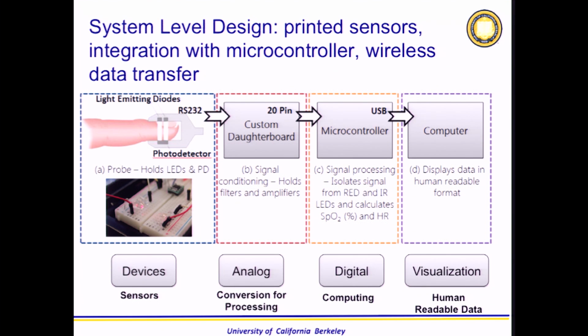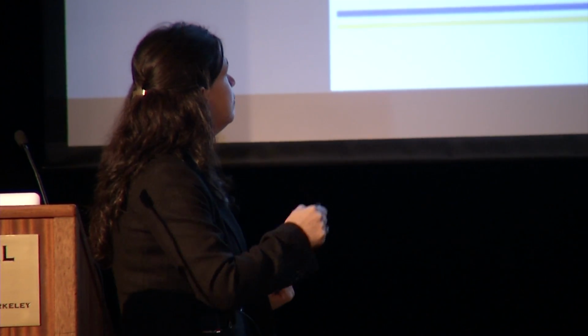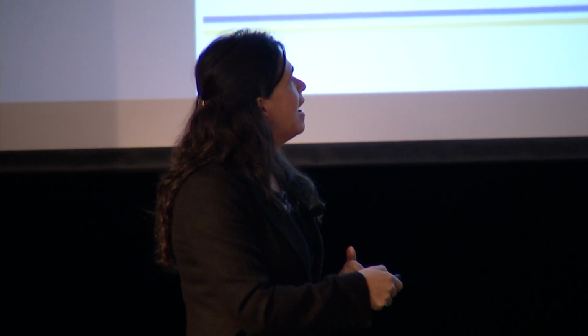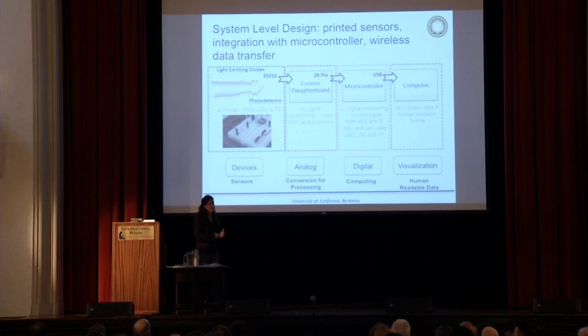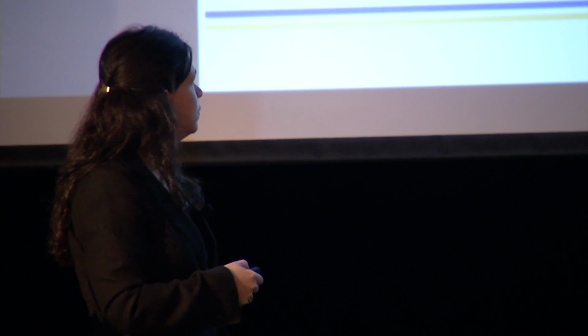So what I think in terms of flexibility, what needs to be flexible, what needs to be wearable, is that we could easily make the devices here and some of the analog circuitry flexible. We could transmit the data via RF, so that via wireless, so that we don't need to have those wires coming out of us anymore. And of course, this could be displayed in a computer, could be displayed on our cell phone. It depends on the setting that you are at.